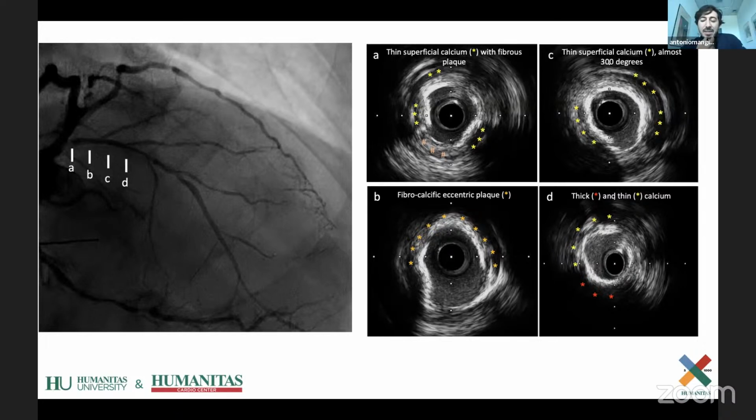Okay. And Azim, I think another good sign is that we were able to do the baseline IVUS. Exactly, it's true, because I'm surprised the catheter passed. Yeah, and this is an IVUS from Boston, which is a little bit bulky. So it's always a good sign.